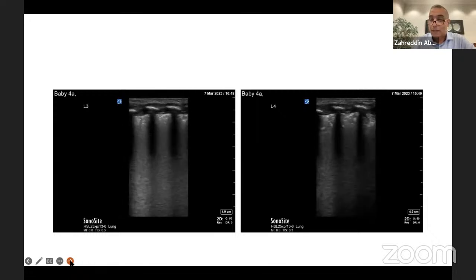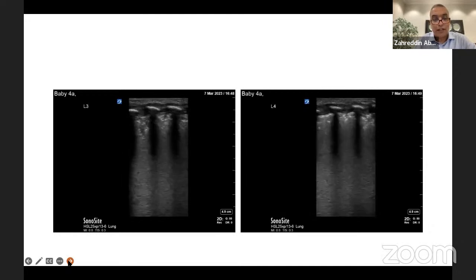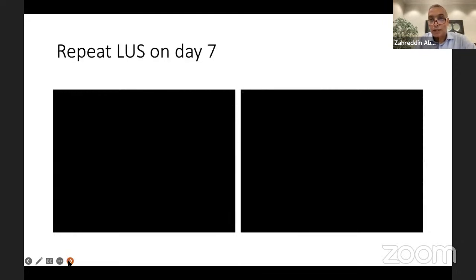Then obviously your comments, Alok and Almudena, spot on. I think we gave this surfactant, but still we went up on the ventilator settings. It looks like the lung did not respond just to the surfactant. They needed a bit more pressure, so the pressure went up. Maximum was 26 peak inspiratory pressure. Once we reached that opening point, things improved overnight, and the baby's oxygen requirement went down from 60% to about 25% by the following morning, and the blood gases were much better.